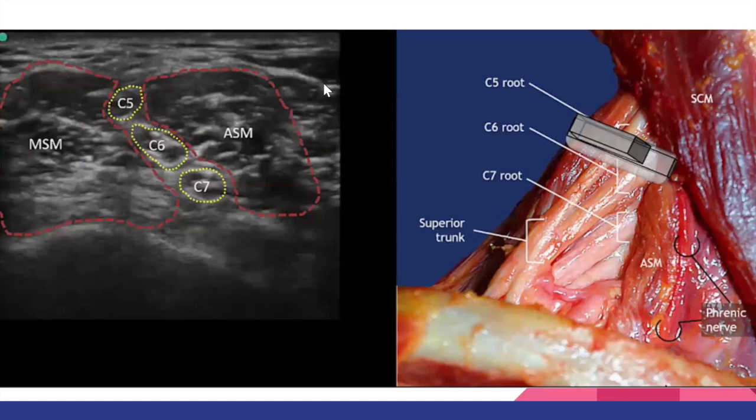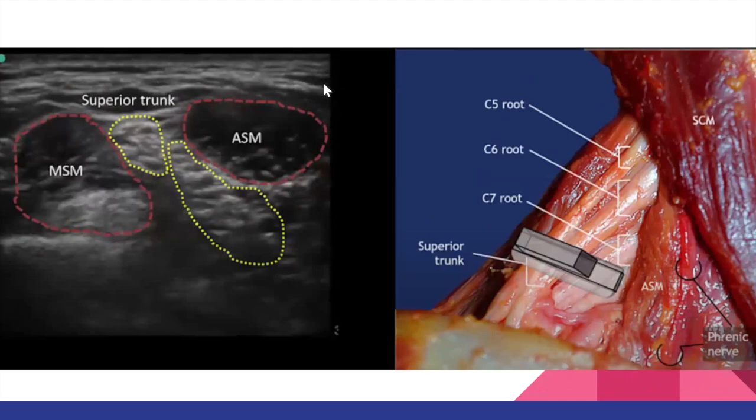Just to bring it home, this is Jamie's anterior scalene. You scan down and then beefy structures, superior trunk. What I like to do, instead of just randomly placing my probe and hoping that I find these anatomical locations, and this is what Kazi does too across the street, you can always just start at the clavicle. You'll see your subclavian artery, a really nice landmark, and then you just start fanning up. As you fan up, you'll hit the superior trunk, fan up some more, and then you'll hit your three stoplight sign. That way it's just an easy progression to find what you need to find instead of just slapping and kind of hoping you find it.